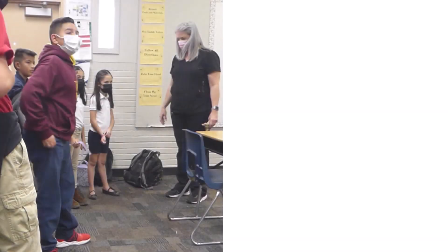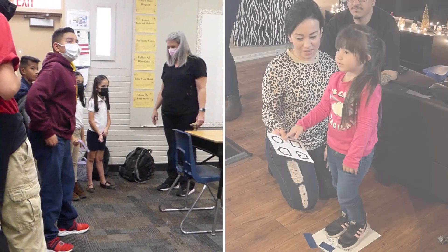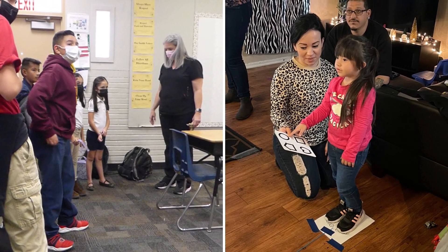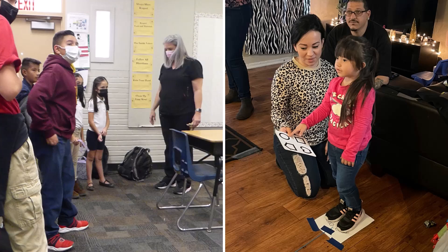The process for conducting screenings at school or community settings differs from that of a home setting. However, screeners should be prepared for each type of screening. We will go through school and community settings first, then demonstrate a home example.